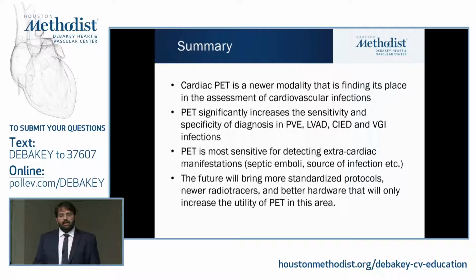To summarize, I would say that PET is a newer modality. It's still finding its place. The best thing about having a multimodality program is that no modality in isolation always gives the answer, so it significantly increases the sensitivity and specificity of diagnosis in these cases. And it's very sensitive for extracardiac findings, either the source of infection or the consequence of infection. And the future is going to bring more standardized protocols, newer radiotracers, and better hardware. We expect that the utility of PET in the future is only going to keep increasing for this indication.